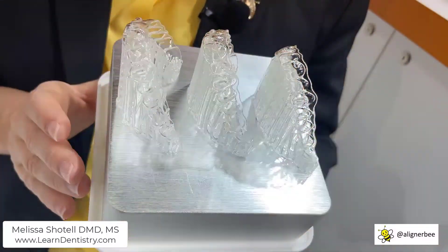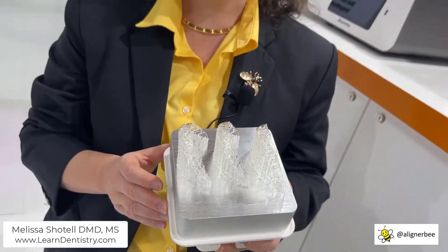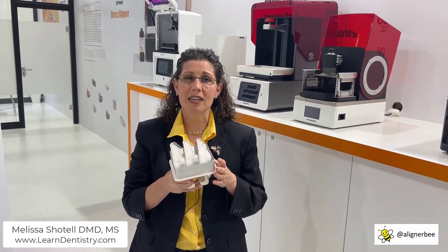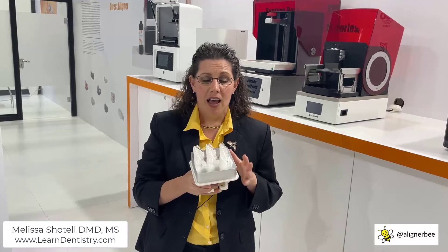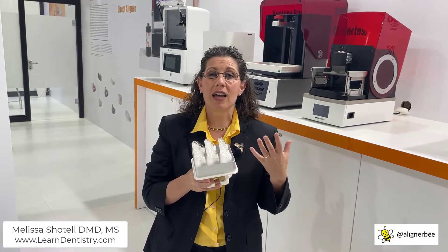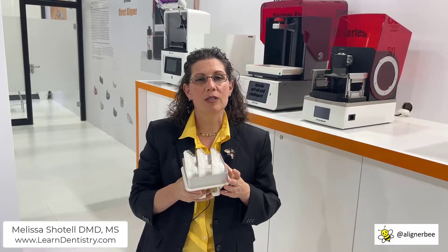We can see the clear aligners printed vertically with a series of horizontal supports. The team has explained that these can easily be removed by hand, and then sent through the post-processing process. The aligners are first sent through a centrifuge to remove the excess resin, and then they go into a light curing unit, both with nitrogen and with glycerin. We always want to make sure we're paying really close attention to that post-processing process, because it can affect the aligner.